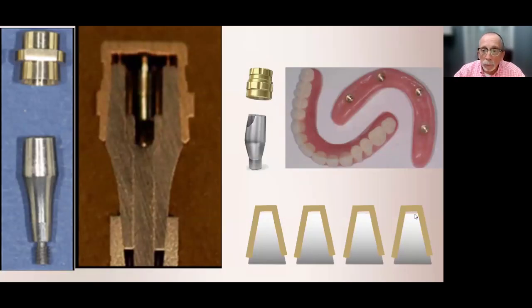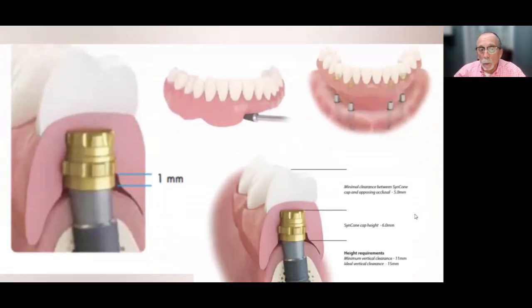more retentive it gets. So this is an appliance we tell the patient, look, you have to take this thing out every day or every couple of days, because if you don't, if you put this in, it's going to be comfortable. It's the chewing power, right? It's retentive, it's great. And if they wear it for a week or two, they're going to really struggle getting it out. They'll be back in the dental office saying, hey, I can't get it out anymore. And that's because of this retention getting better with time. And it is really, really good retention. We just have to coach everybody up to understand how it works.